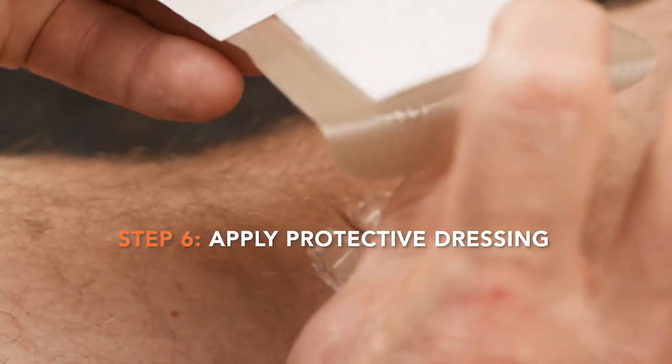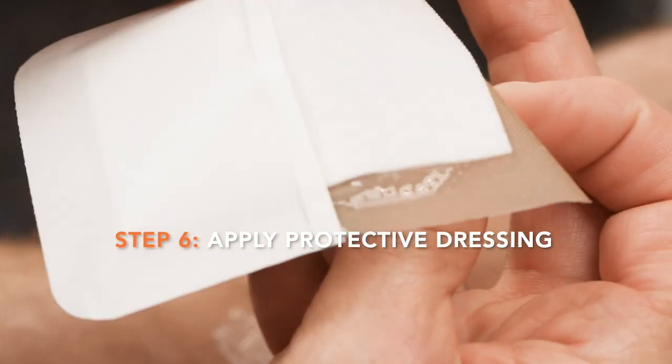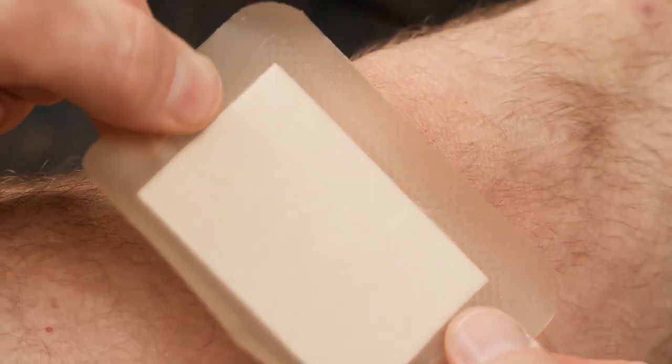Apply a protective dressing over the wound. It is important to prevent the dressing adhesive from touching the Zip Stitch device, so that it is not removed or damaged when the dressing is changed or removed.